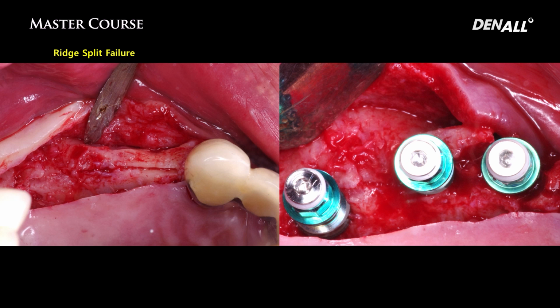In order to minimize various complications in doing ridge split, tools have been developed and a kit called the SET kit was developed. This kit is to be able to do ridge split in an easier way.